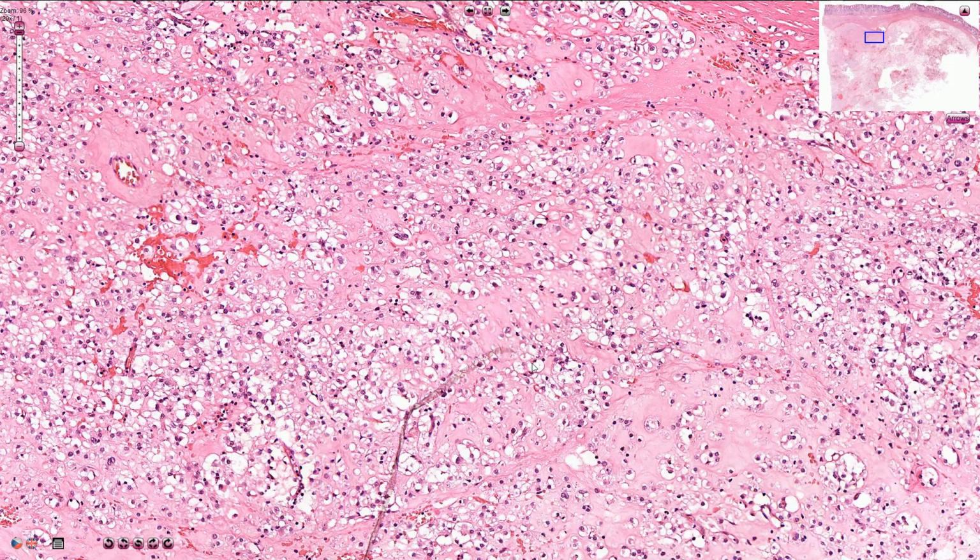The prognosis is quite variable. These tumors can be benign, borderline, or malignant, and for the prognosis, the localization, the diameter of the tumor, and the mitotic count are important.